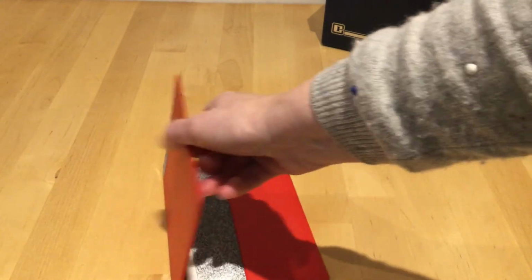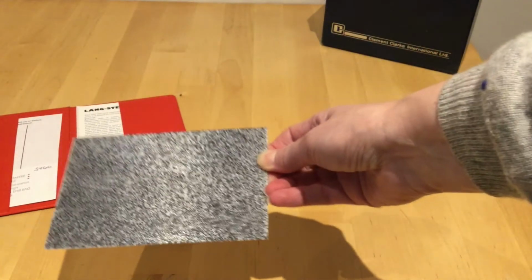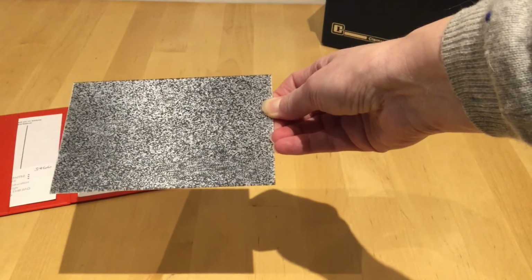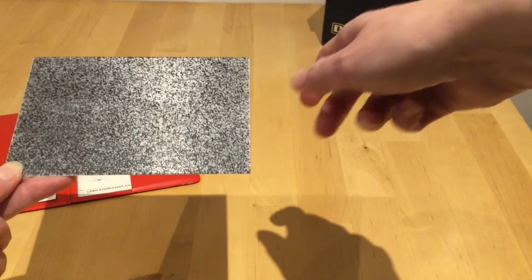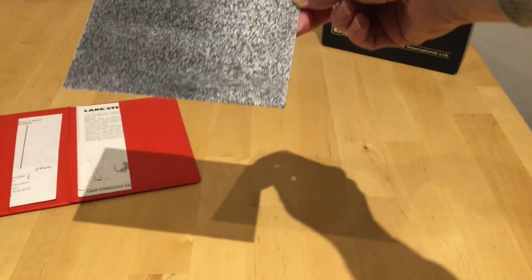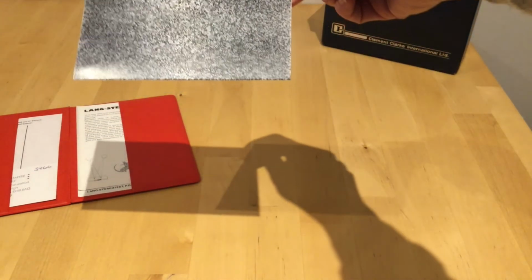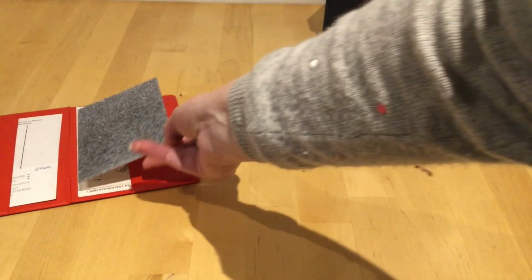And the final one, the Lang stereo test, really not very much to look at all. In here, within this pouch, there is a card, and depending on how I tilt the card, I can see that there is a cat on the left, just here. I can see a star at the top of the card, just here, and at the bottom right there is a car. Again, this will be probably very, very difficult to see through the camera, but there are three things on the card that can be seen jumping out, and I'm not doing anything special here. I'm just looking at it, and it is three items that are quite distinct from the background that are standing out from this card. So that is the Lang stereo test.